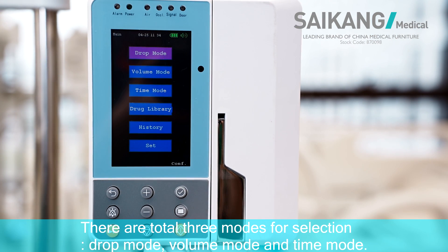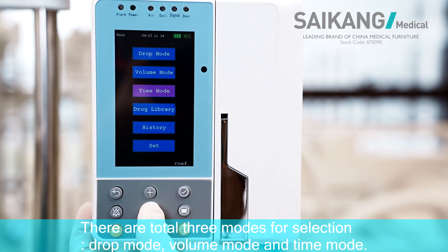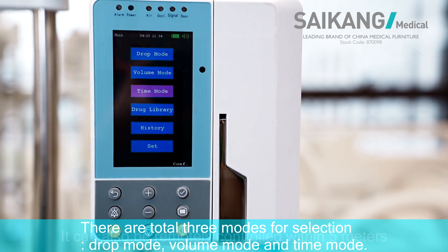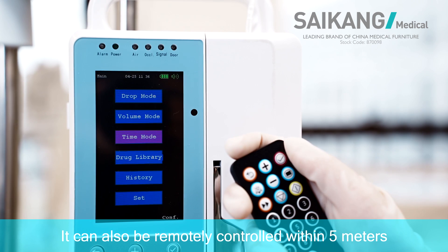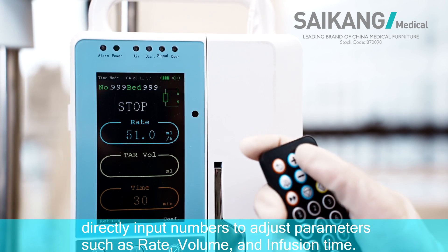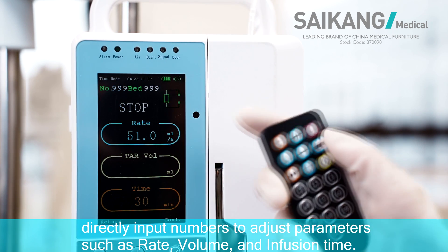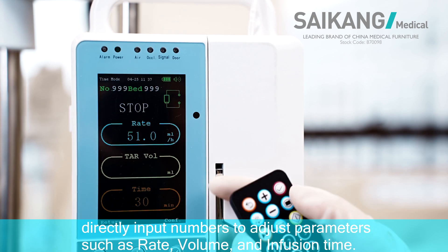There are a total of three modes for selection: drop mode, volume mode, and time mode. It can also be remotely controlled within 5 meters. We can directly input numbers to adjust parameters such as the rate, volume, and infusion time.